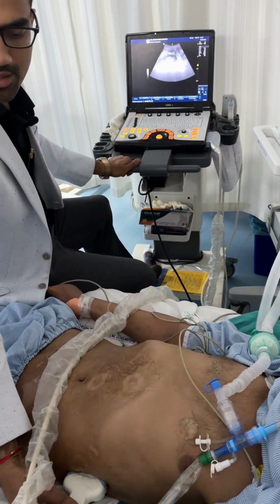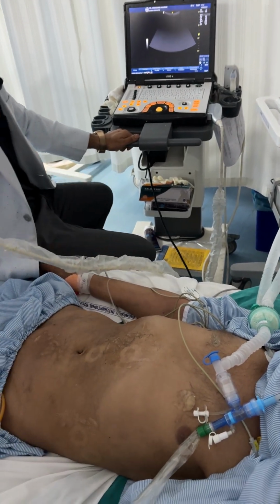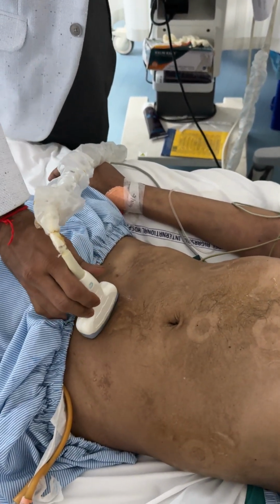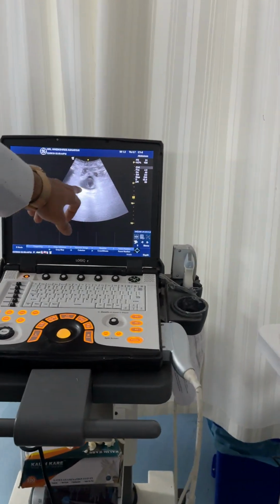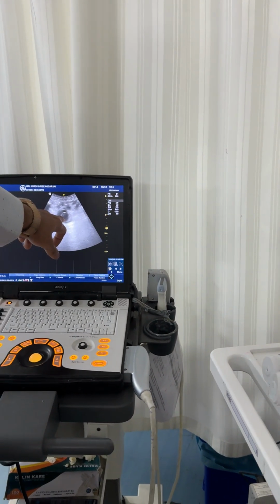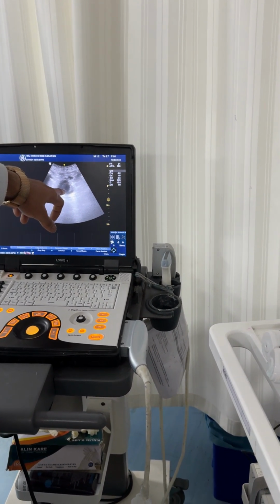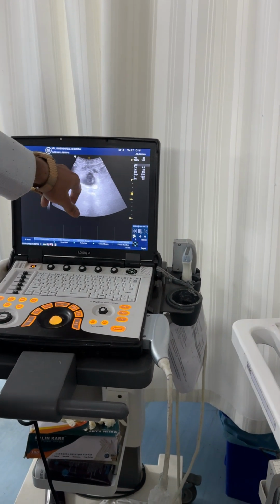That is the focused assessment sonography for trauma. And what is the last view? The last view, the pointer again pointing towards the right shoulder, you place just in the suprapubic space, transversely. So this is an intubated patient where the full bladder is not there. But what I can see here is the Foley's catheter. See, this is the Foley's catheter. Can everyone see that?